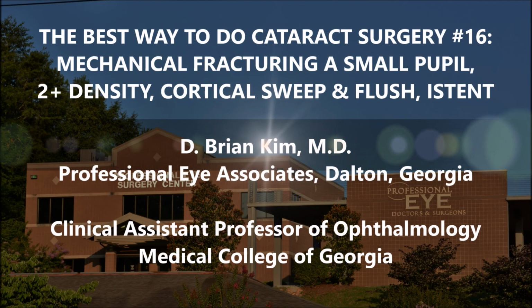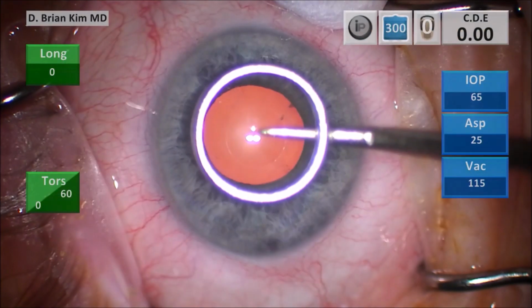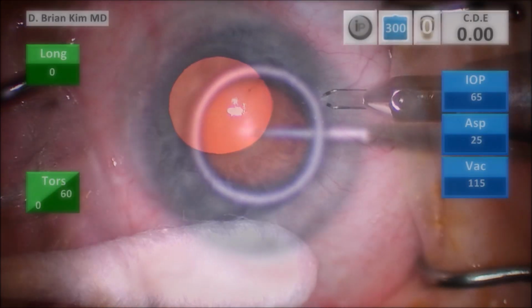I'm going to share with you case number 16 in the best way to do cataract surgery series. This is a small pupil with a 2+ dense lens. I'm going to show you the double chop, cross chop, mechanical fracturing techniques, and doing the cortical sweep and flush, and lastly an i-stent. So I make my corneal mark to help me center and size my rhexis.